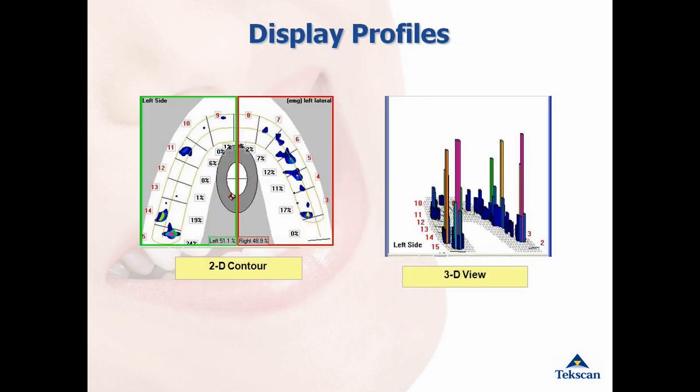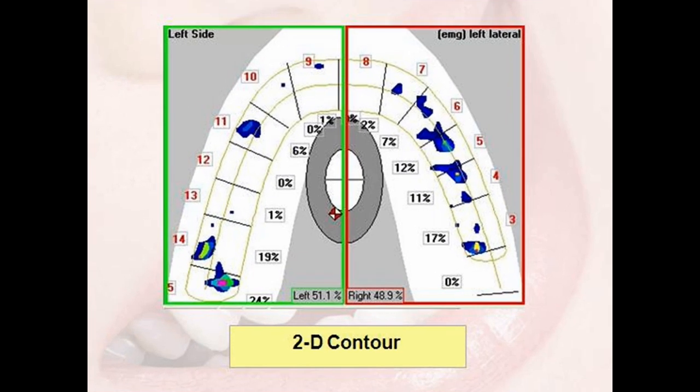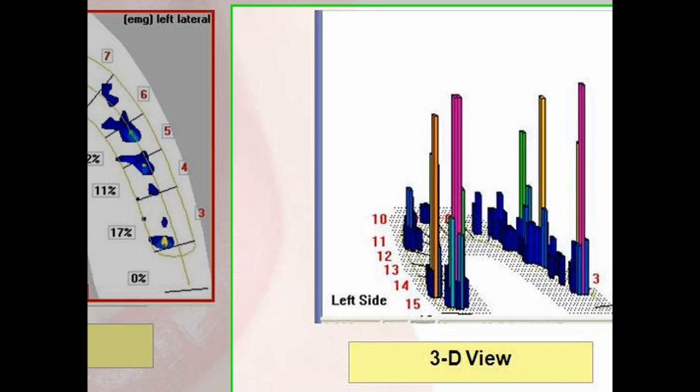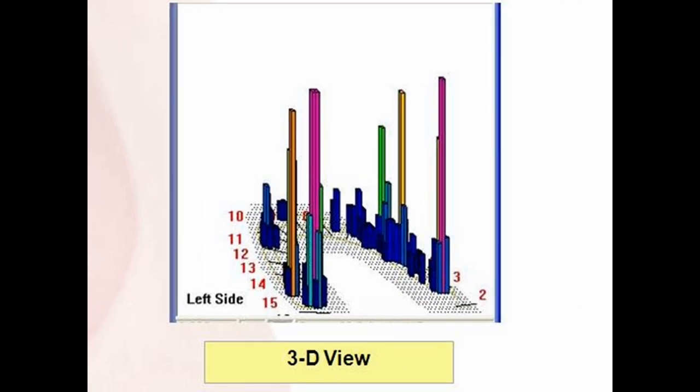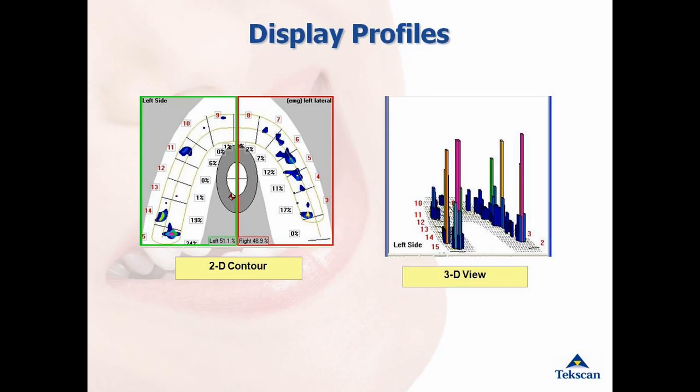T-Scan displays the data in many different ways. As you can see in this example, there is a 2D contour view that most closely resembles articulating paper marks. There is also a 3D view which is a great tool for patient education because you can see the height of the column correlating with the intensity of the force.